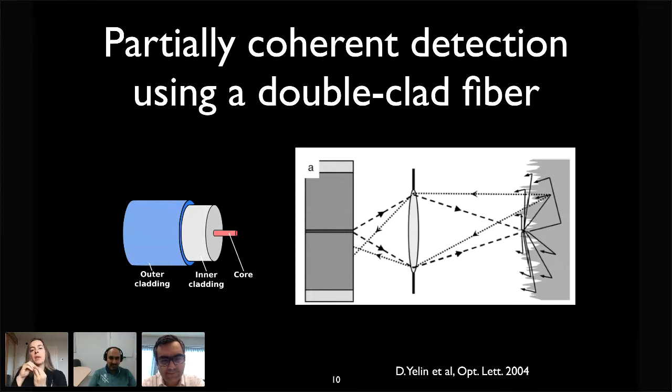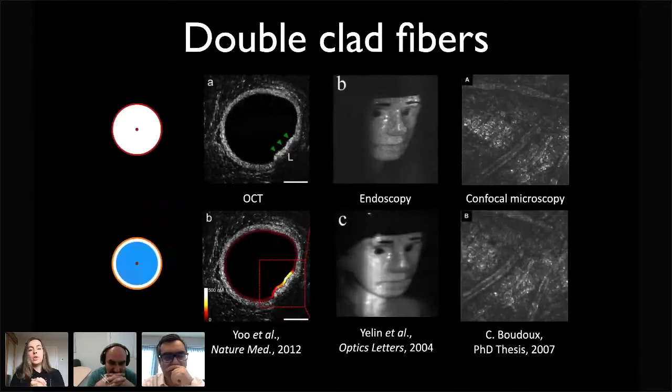The tissue scatters quite a bit. And when it does, you lose the phase, but also you lose the directionality. And so very little light comes back into the core. In addition, since we are using a laser, what we observe is speckle noise. Because our laser is coherent, if we only select through this very small pinhole, the core of the fiber, the light that is coherent, we are going to get interference noise that makes the image very tricky to observe.